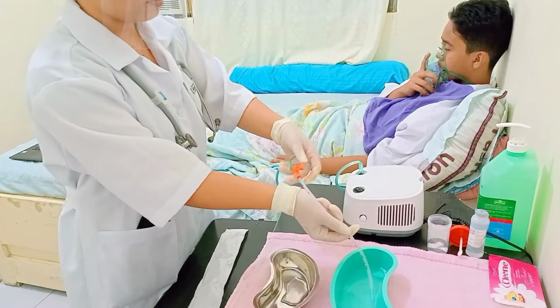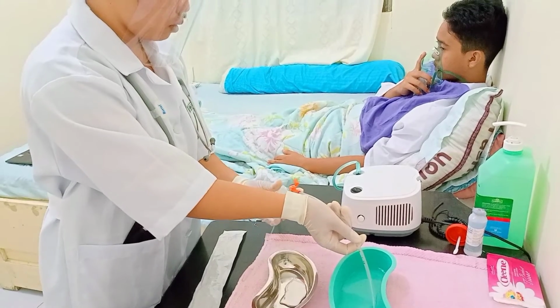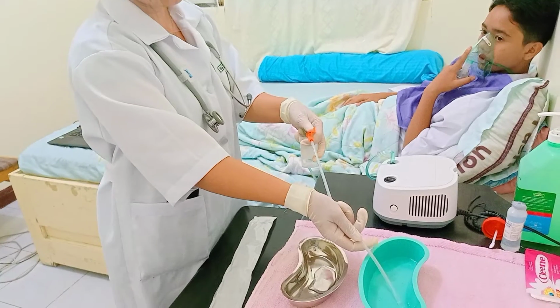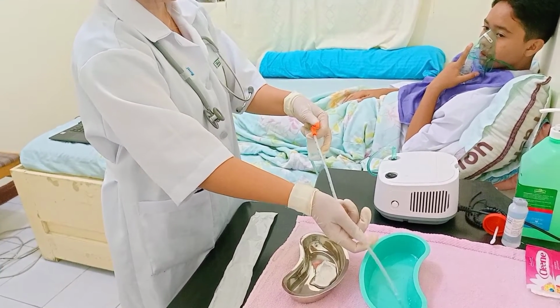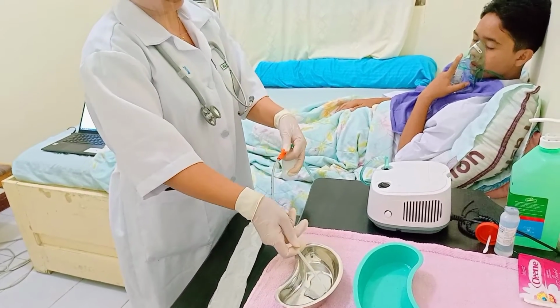Next, obtain specimens if required. Attach the suction catheter to the tubing of the specimen trap. Touch the suction tubing to the specimen trap's air vent. The specimen trap will collect the mucus during suctioning.